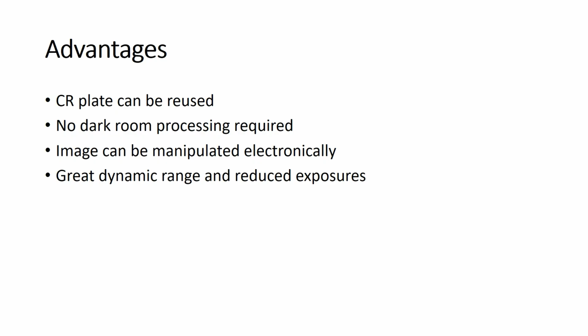Let's discuss the advantages of the computerized radiography system. In the CR system, the major advantage is that you can use the CR plate many times.